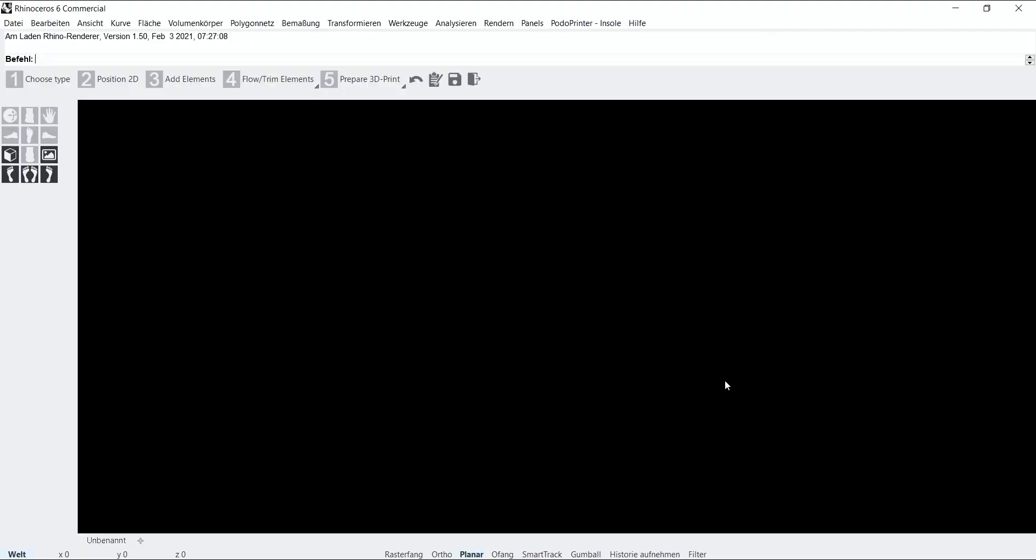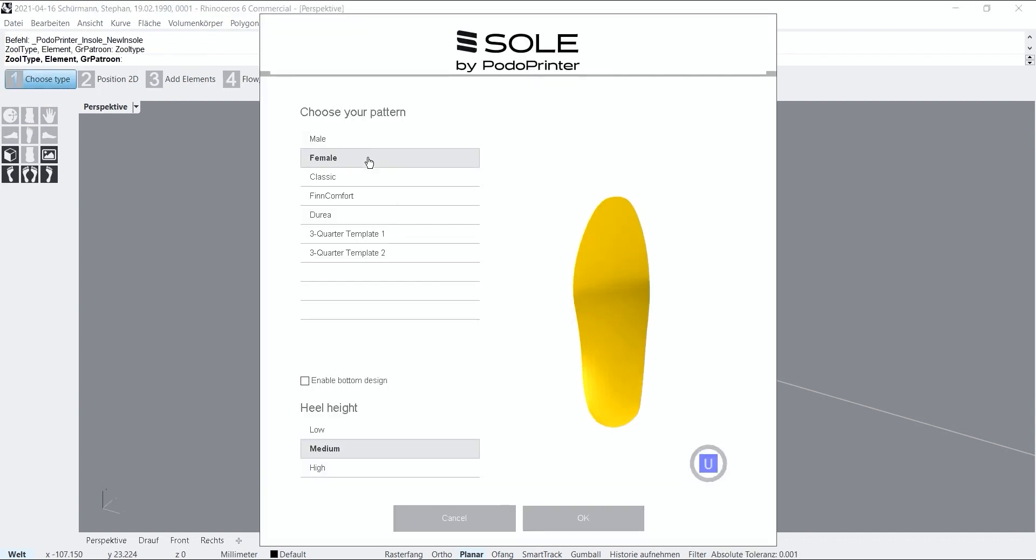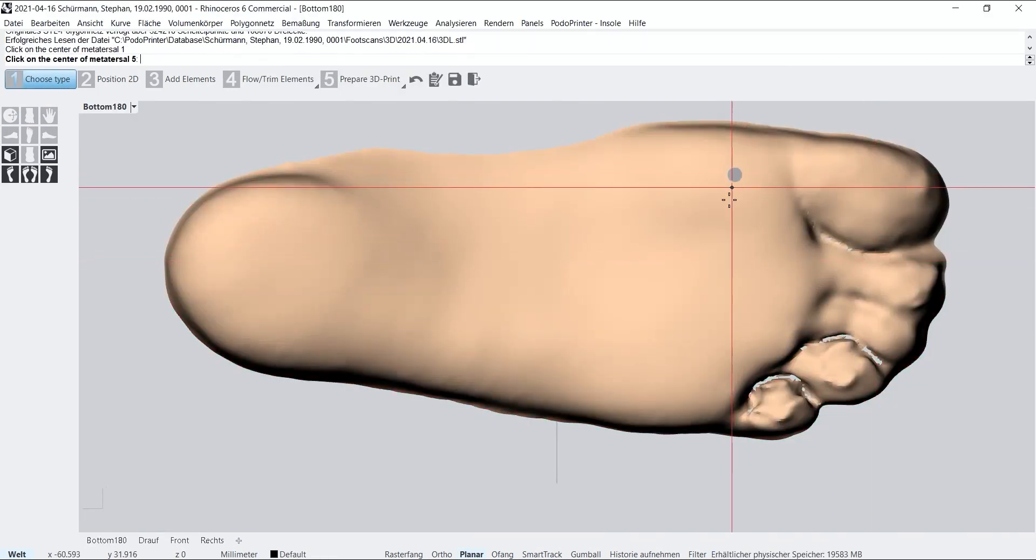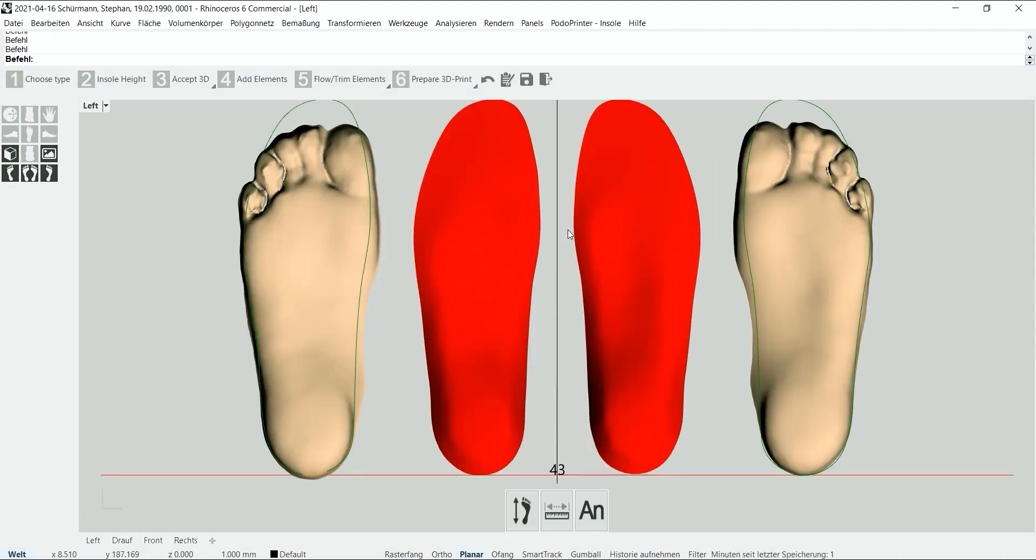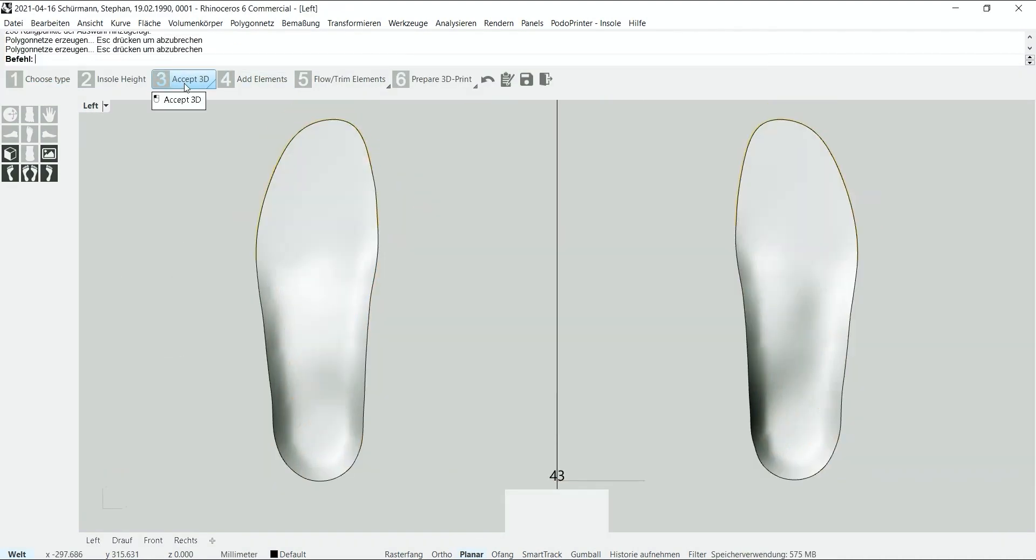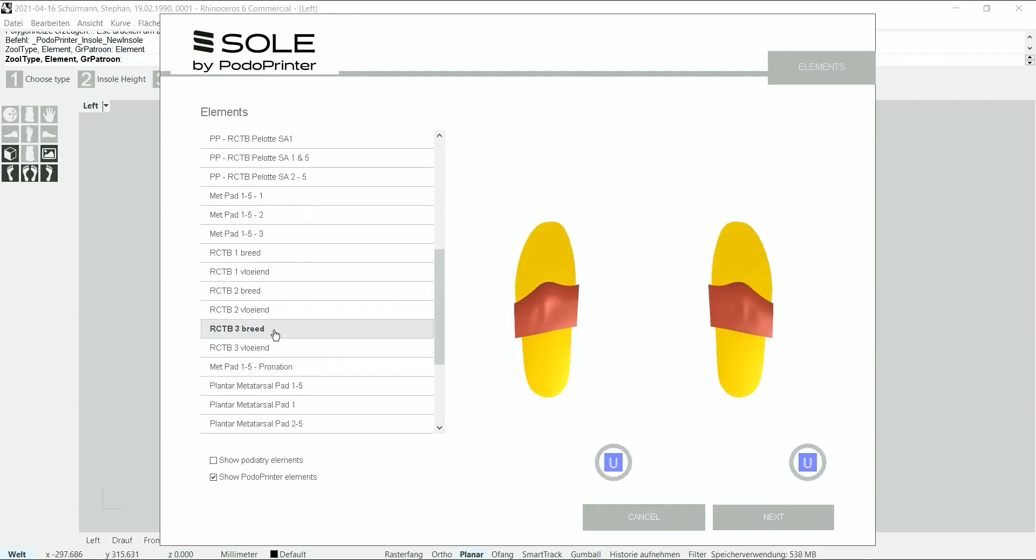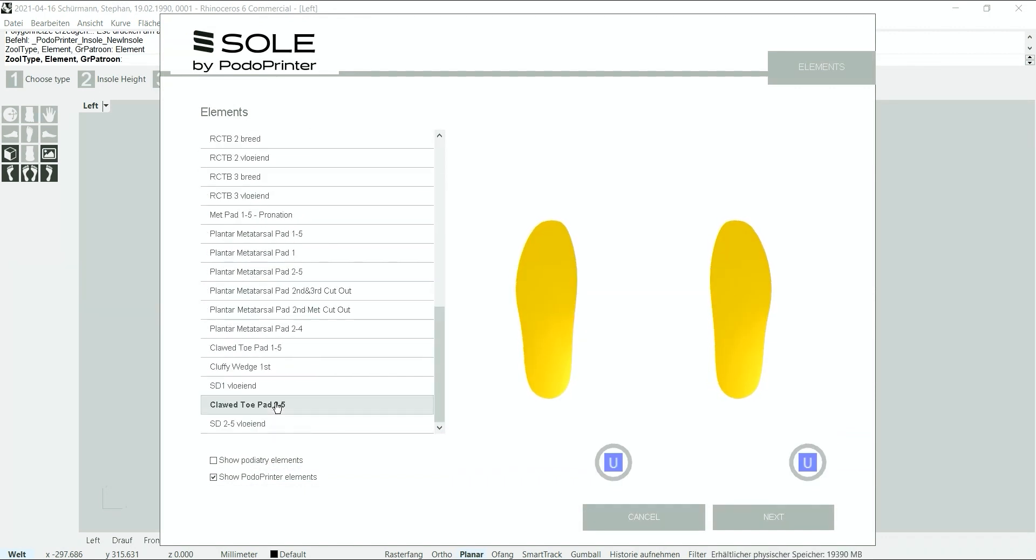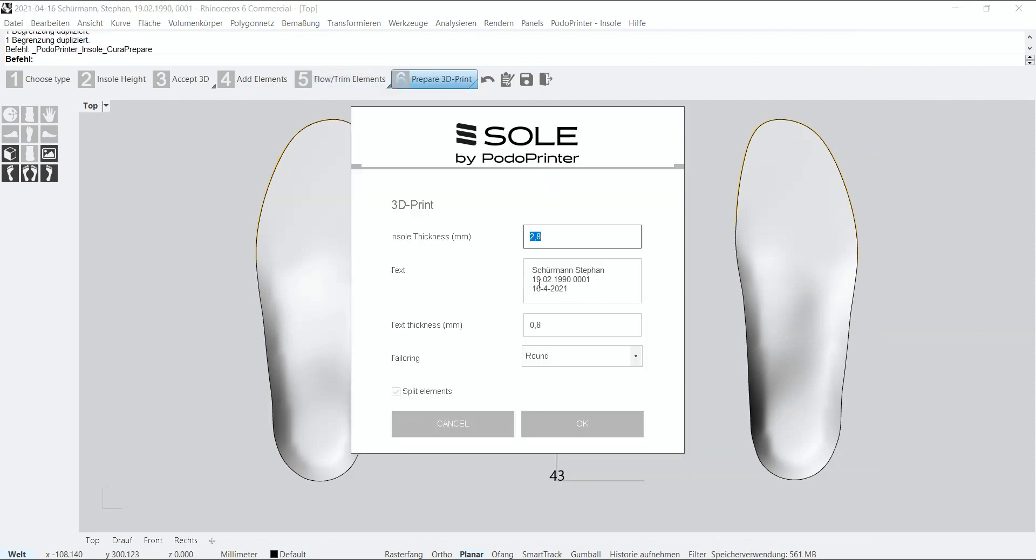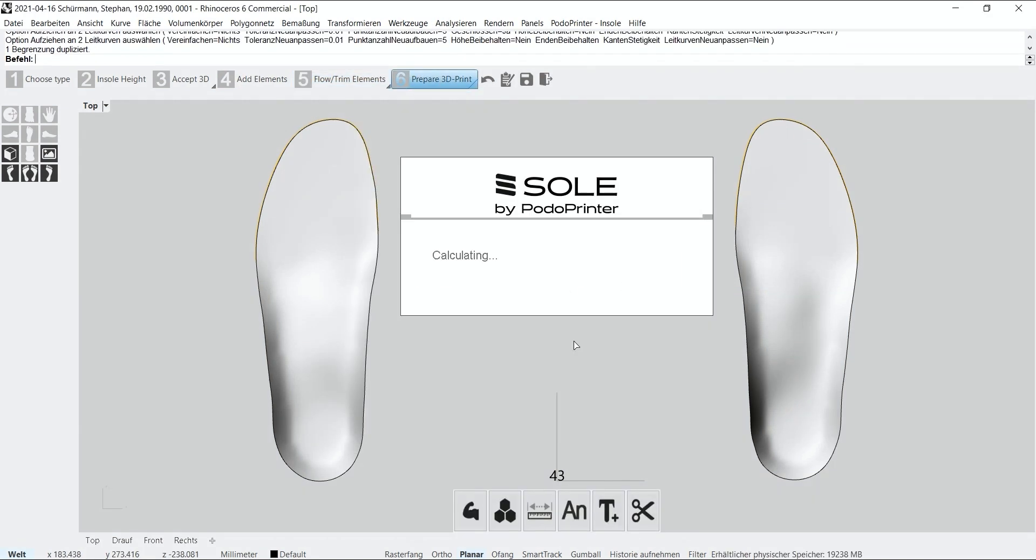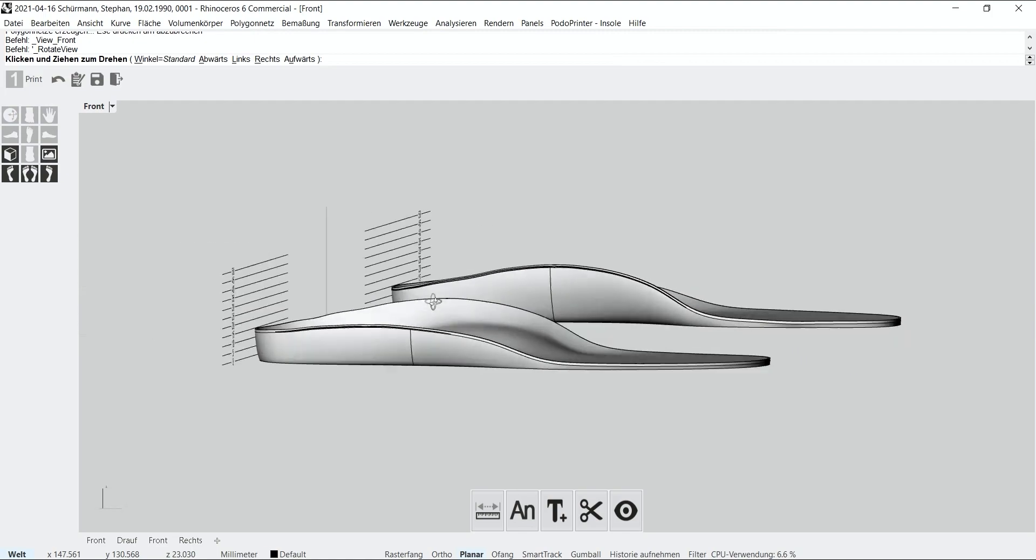Our design process starts by selecting the type of insole and aligning the 3D scans. The full contact insole is being generated automatically, so that specific elements can be applied according to the patient's conditions. Now we can add text to the underside and select hardness for each element.